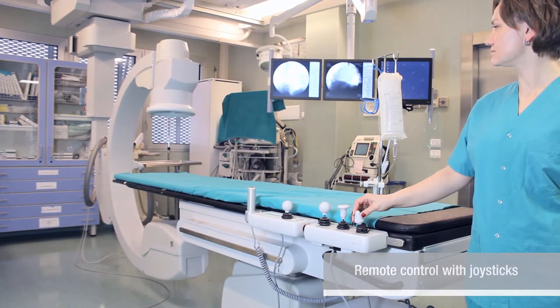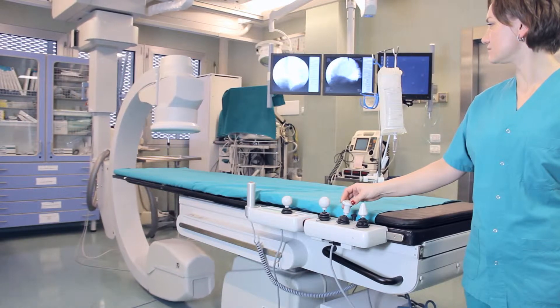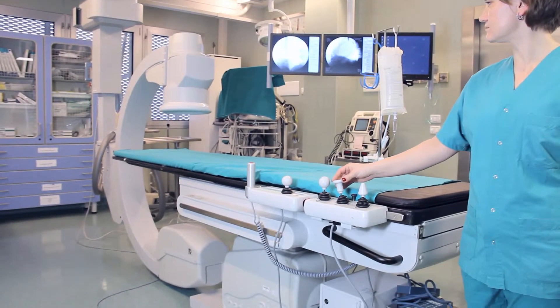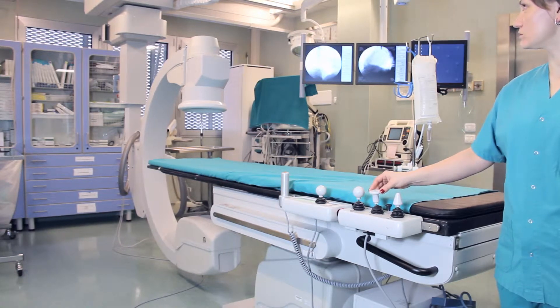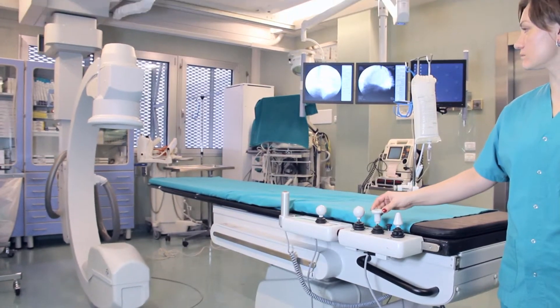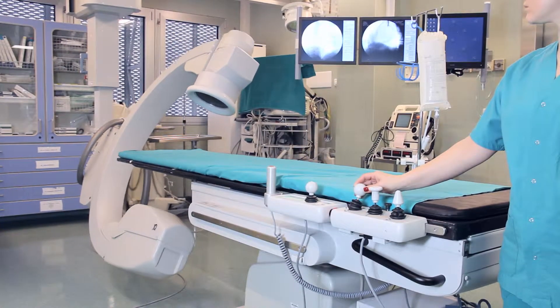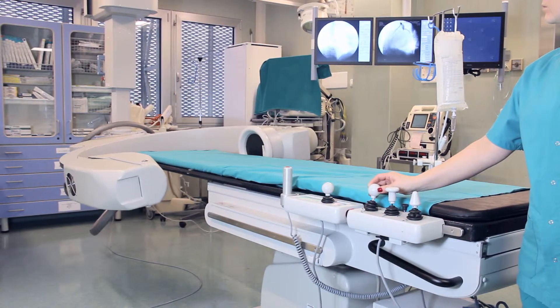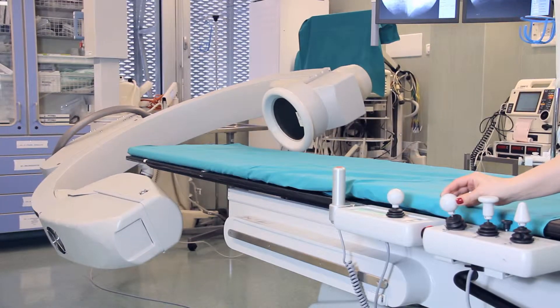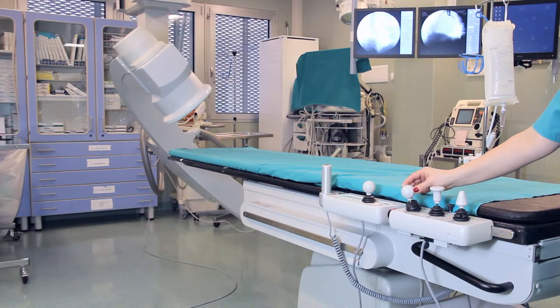The equipment moves easily and smoothly. Thanks to special sensors, it is reliably protected from any collisions. The ceiling rails allow a wide range of movements of the arch in longitudinal and crosswise directions. A lateral turn of up to 360 degrees allows bringing the unit into any position. The speed of movement can be regulated by pressing the joysticks.